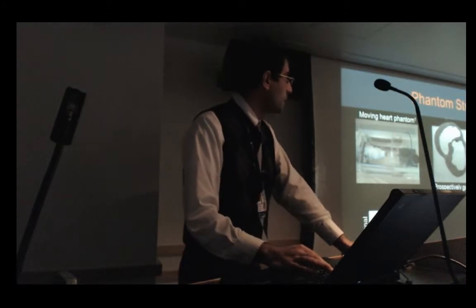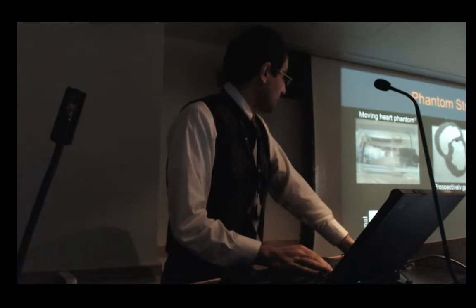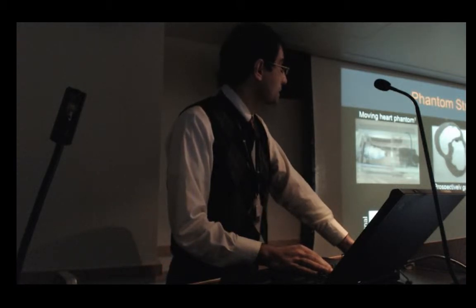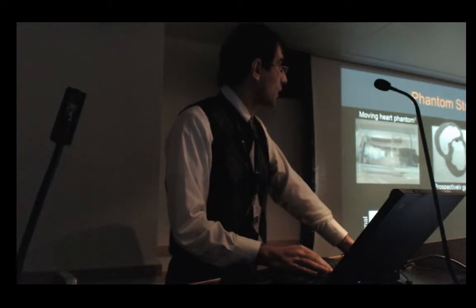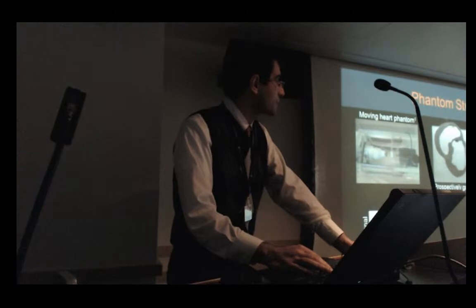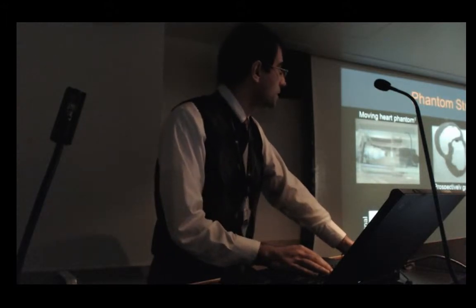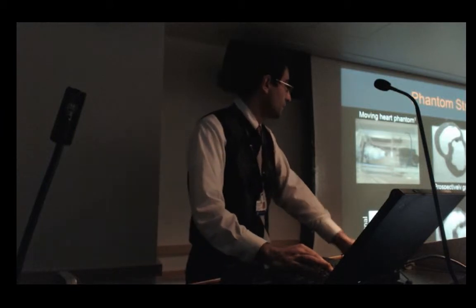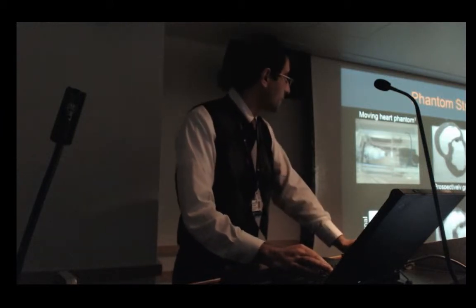First, we acquired the conventional 3D SSFP image from the phantom to use as a gold standard. That image took around 10 minutes because we had to reject the motion-corrupted k-space lines that I acquired outside the 5 millimeter gating window, and then reacquire them. And then we use the Cosmo algorithm.